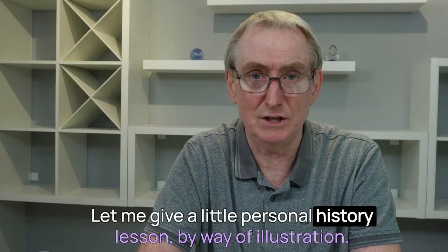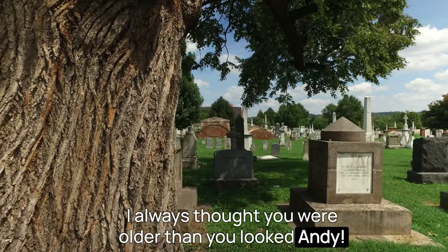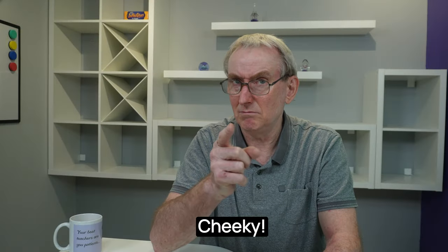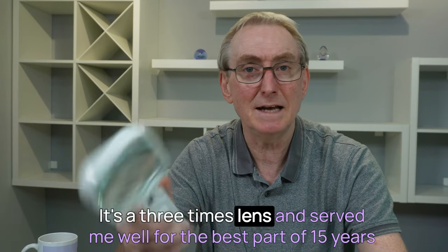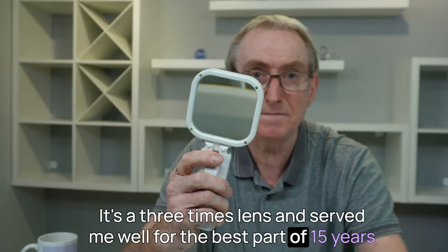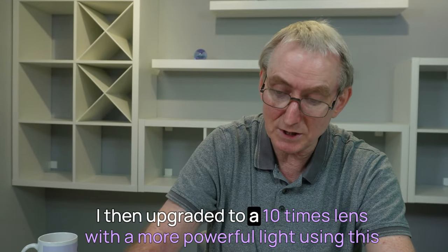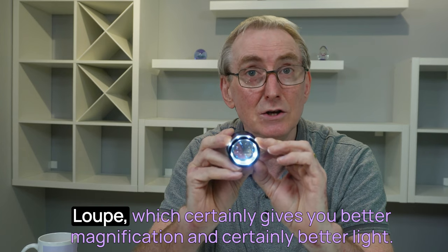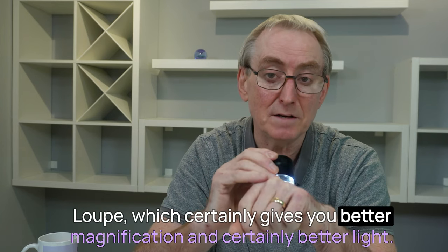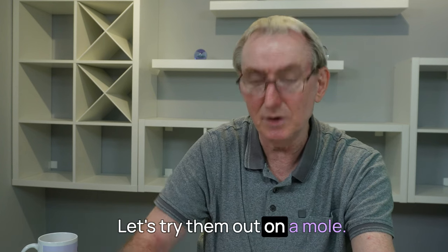Let me give a little personal history lesson by way of illustration. Here's my first magnifying glass — a 3x lens that served me well for the best part of 15 years when I started out in practice. I then upgraded to a 10x lens with a more powerful light using this loop, which certainly gives you better magnification and certainly better light.